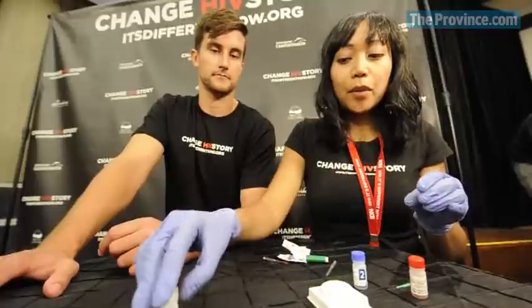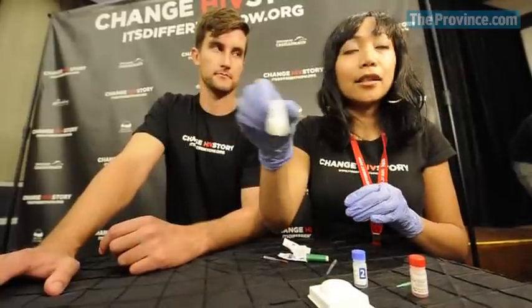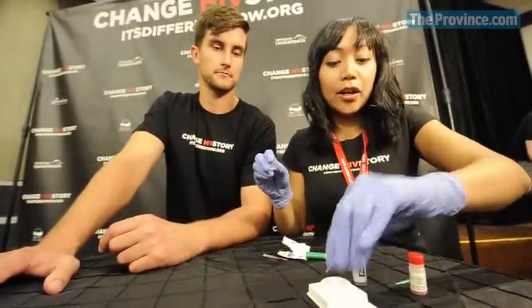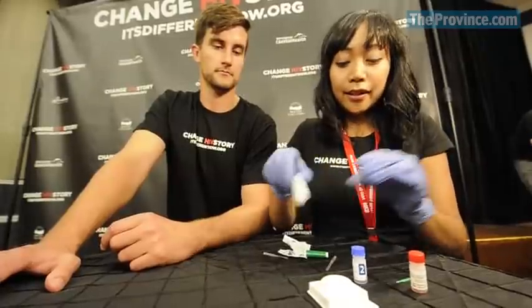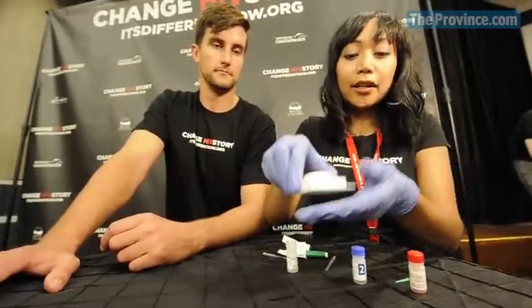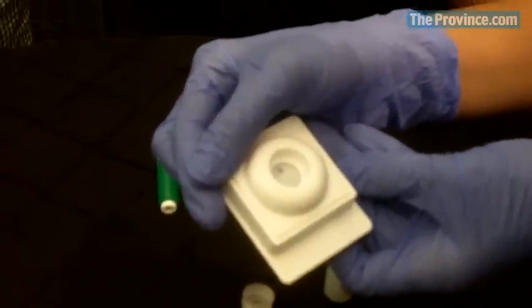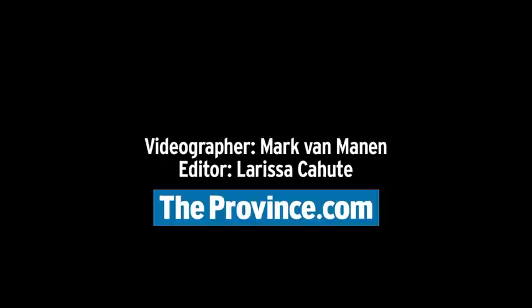And then bottle number three, the last step — I pour the entire contents into there. Then I would show the result to Aaron so you can see it, and this is one dot, which means that this is a negative result for HIV antibodies.